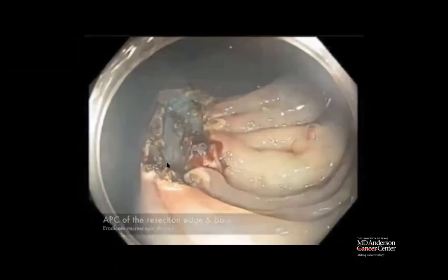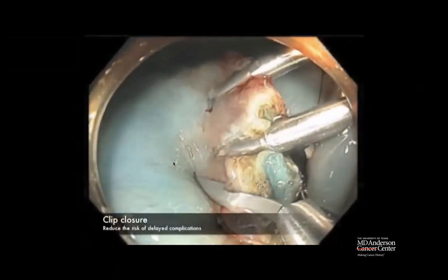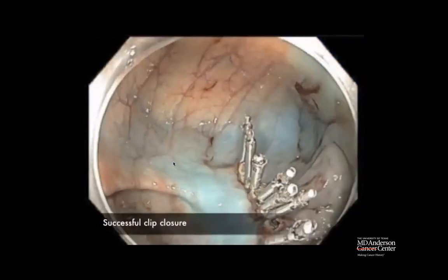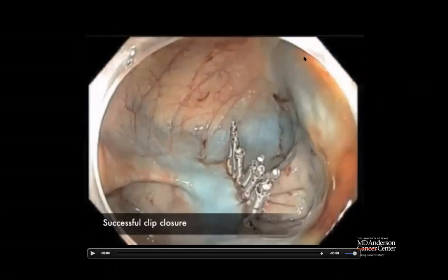And then we close the defect with the clips. Nice. And we know that for large defects, complete closure has been shown to be beneficial in preventing delayed bleeding.